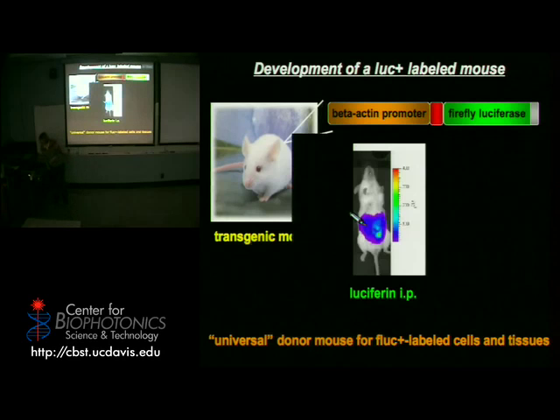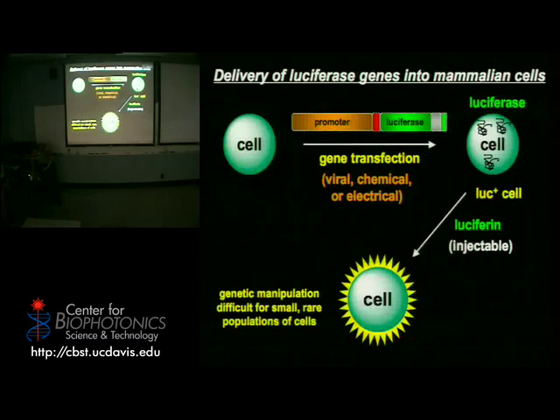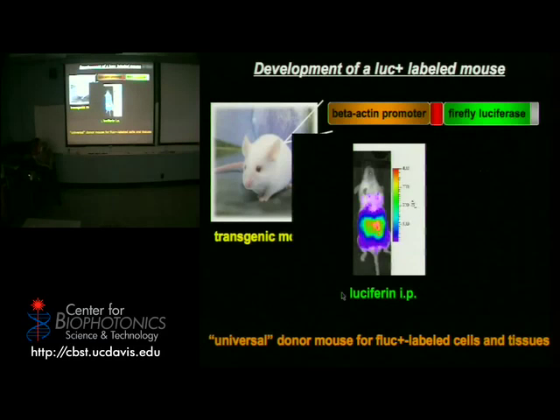Okay, I'll show you here. Once luciferin is put into the IP cavity, you'll see the molecules diffusing around. This is an image acquired over about 20 minutes. We'll play that again. You'll notice the brightest spot was right over the area where it was injected. And then the molecule slowly diffuses out of that area and around the rest of the body. Okay, so here we go. Right where the edge of that needle is, you'll see the most intense signal being given off in the intraperitoneal cavity, is what IP stands for. It's just right in the space near the abdomen.